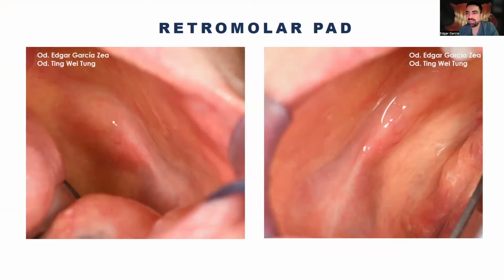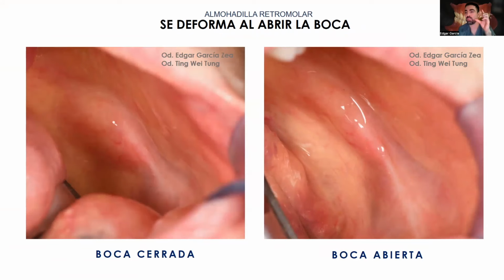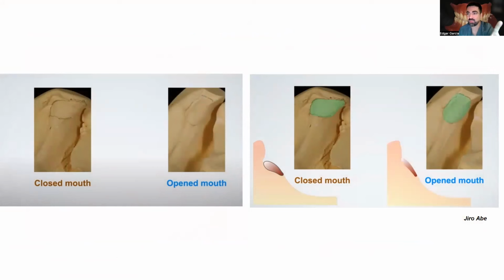I think that the one on the left. That's the most common answer of the doctors. But let me tell you, it's the same retromolar pad. What's the difference? This one is when the patient has the mouth closed, and this one is when the patient has the mouth open. So the retromolar pad changes drastically when we open our mouth.